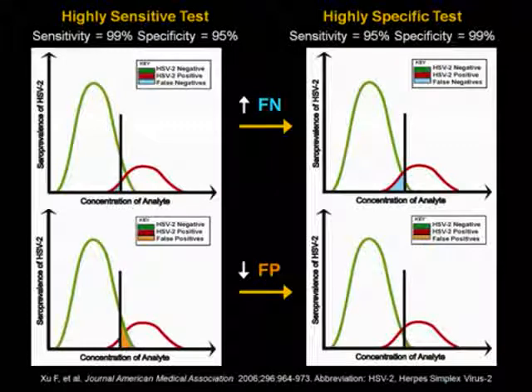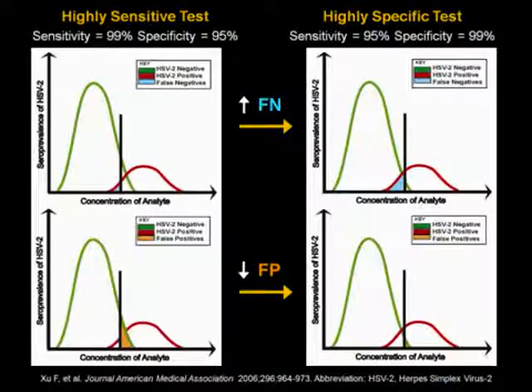I hope this graphical illustration is a helpful tool for explaining the sensitivity and specificity trade-off in regards to false positive and false negative results.